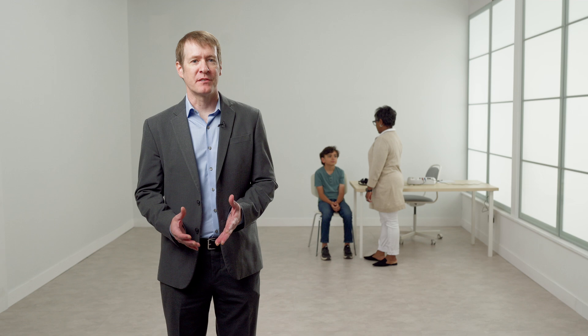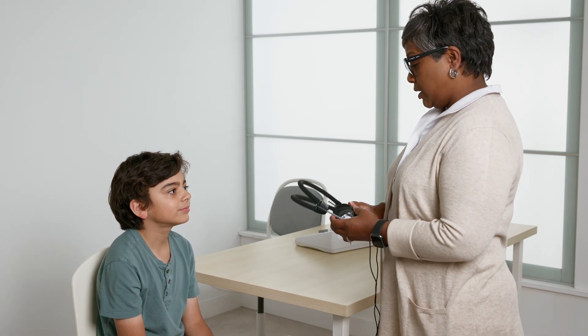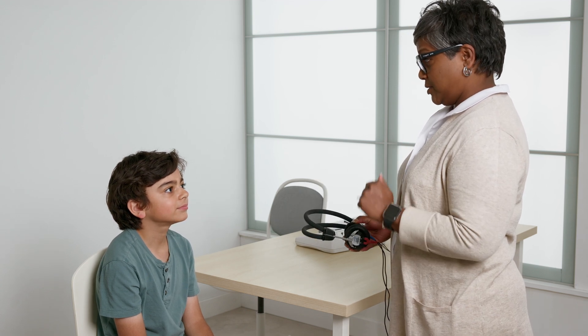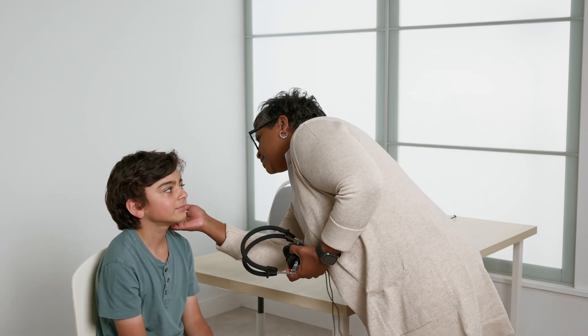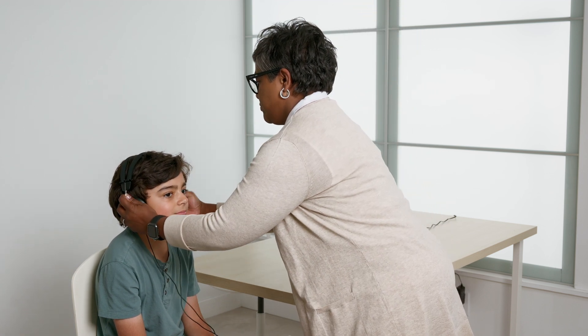Before placing the transducers, it is recommended that you inform the patient what to expect from the evaluation. Explain that you will place the headphones over their ears and that they will hear a series of beeps or tones. Instruct the patient to respond to the tones even if they are very soft or far away, by either raising their hand or pressing the patient response button. Once the patient understands the process, place the transducers over the patient's ears, making sure the headphones are centered over the ears. Make sure the headphone labeled R is over the right ear and the headphone labeled L is over the left ear. If adjustments are needed, remove the headphones so the distance between the headband and the earphones can be adjusted up or down depending on the patient. When the transducers are properly placed, testing can begin.